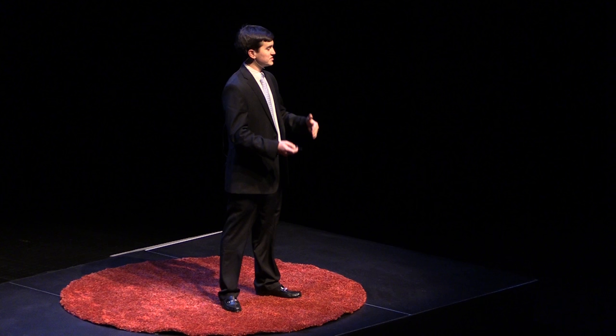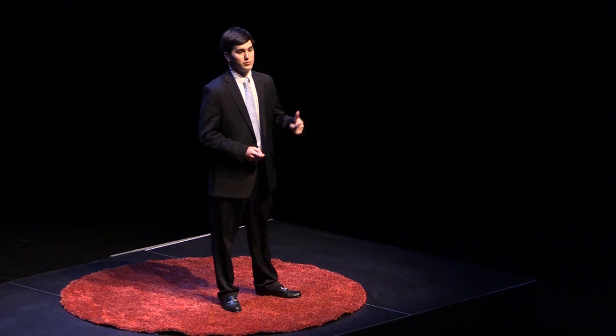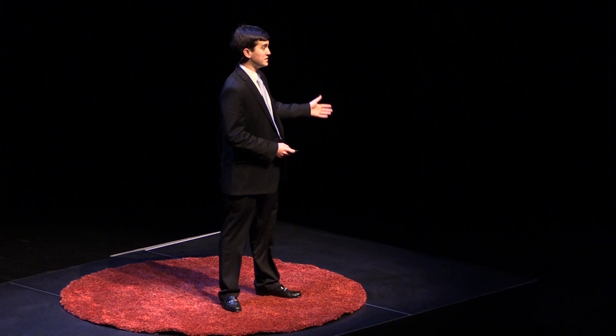We are a student volunteer-run group that wants to create prosthetic devices — hands and beyond — for kids like Holden. Thanks to the support of the Carolina community, we were soon able to get a 3D printer and the materials we needed to make more of these hands. We got Holden the hand he really deserved: the Raptor hand, created by a group called Enable. It has bigger fingers, which allows it to pick things up better, and 3D printed snap-in pins that reduce the amount of metal hardware needed. It's just a better design all around.